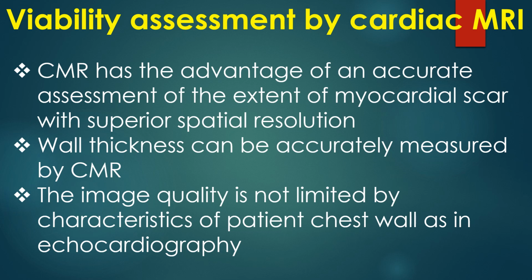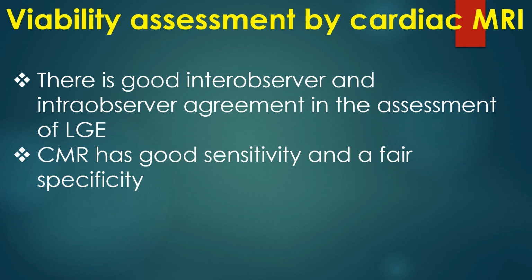Wall thickness can be accurately measured by CMR. The image quality is not limited by characteristics of patient chest wall as in echocardiography. There is good inter-observer and intra-observer agreement in the assessment of LGE. CMR has good sensitivity and a fair specificity.